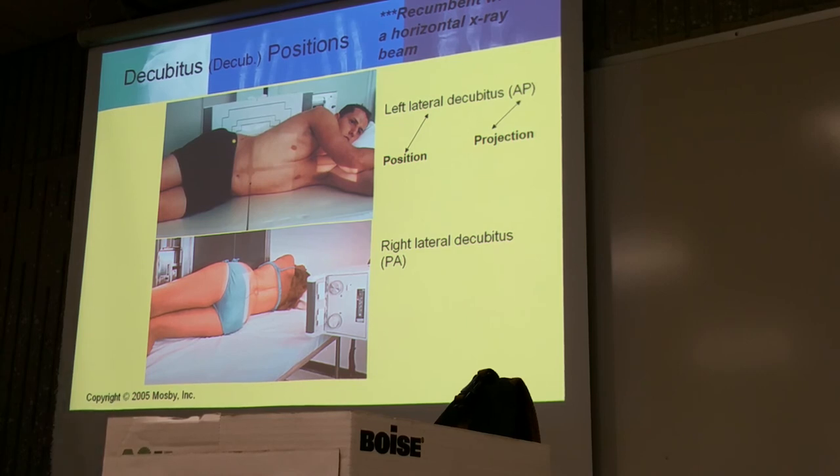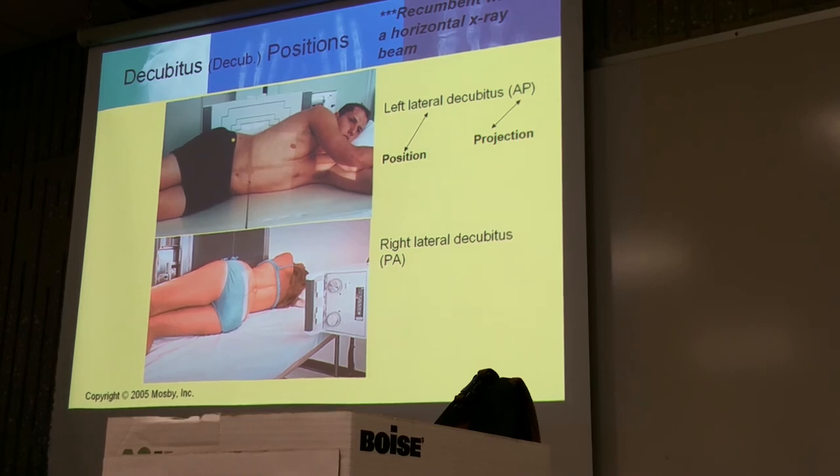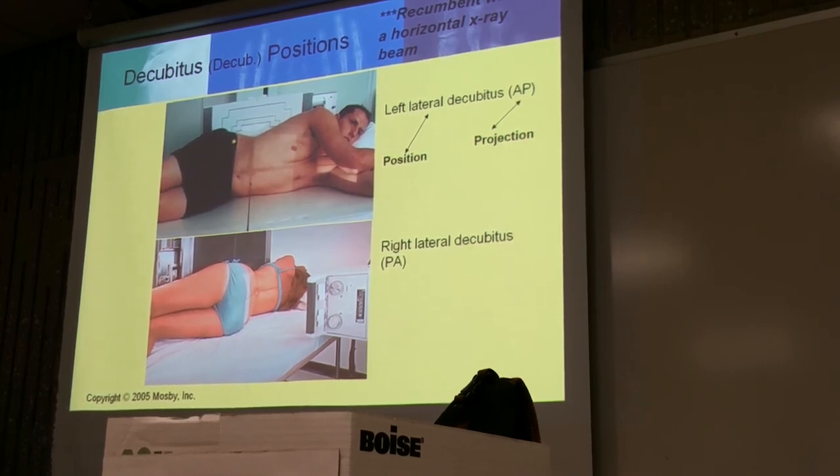Decubitus images or examinations only apply to the chest and the abdomen. We good? All right.